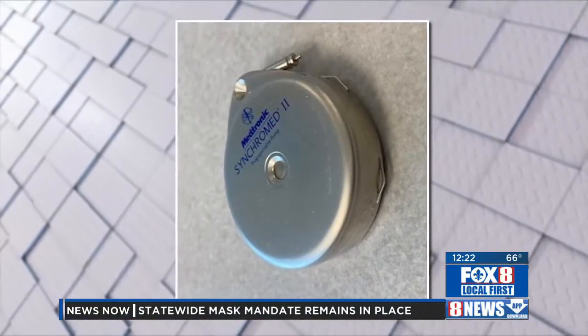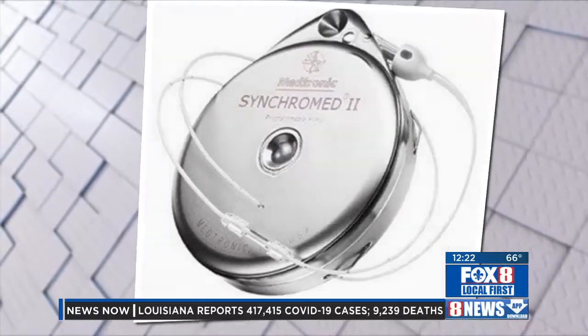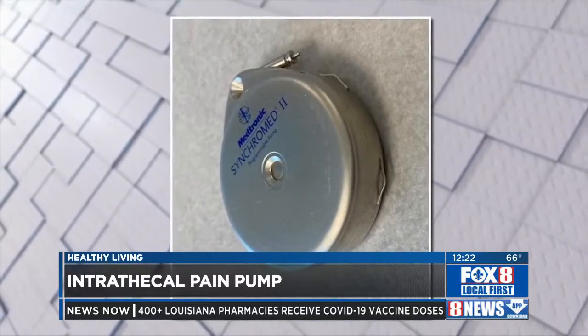Which type of patients would benefit from this medical pain pump? Yeah, so this is the actual device that I'm holding in my hand. Pain pumps are basically a last-ditch effort for people with chronic pain. So I'll make that very clear to the viewers. This is not something you go to first up. These are people that have failed surgery, people with major neurologic diseases such as multiple sclerosis, rheumatologic diseases such as rheumatoid arthritis. So we're talking about people that have diffuse pain, that have failed physical therapy, surgery, injections. So this is a device that allows us to control this pain with a safer measure of giving opioid medication. Okay, so it really is a last resort that you would be turning to.